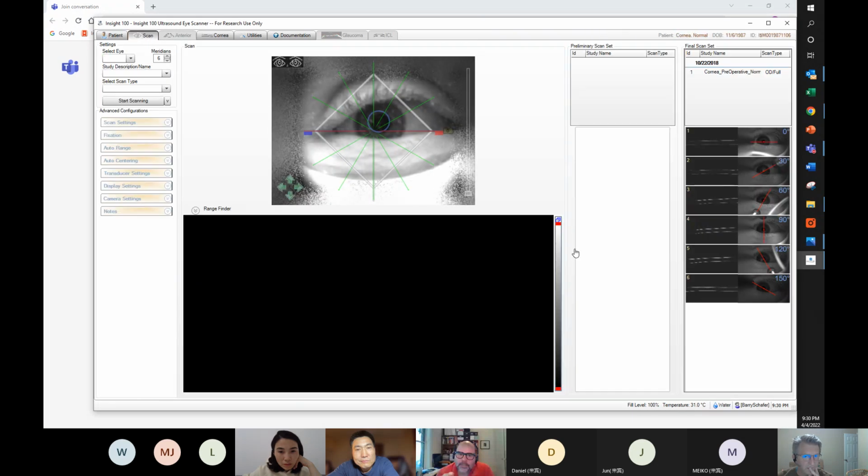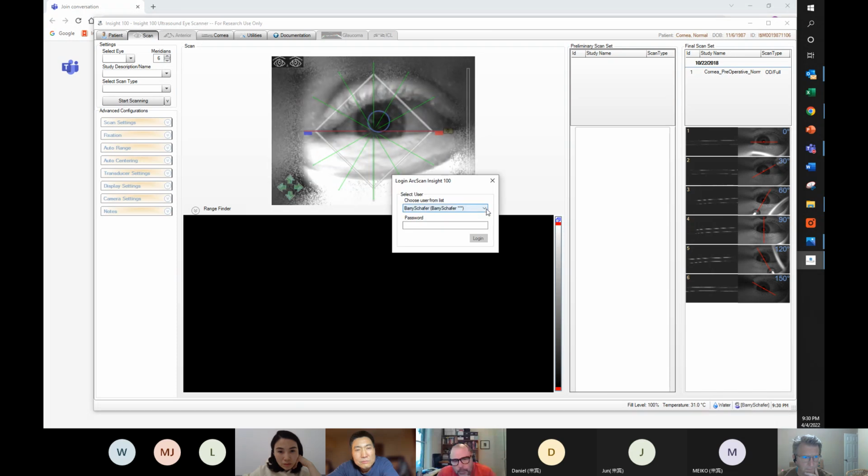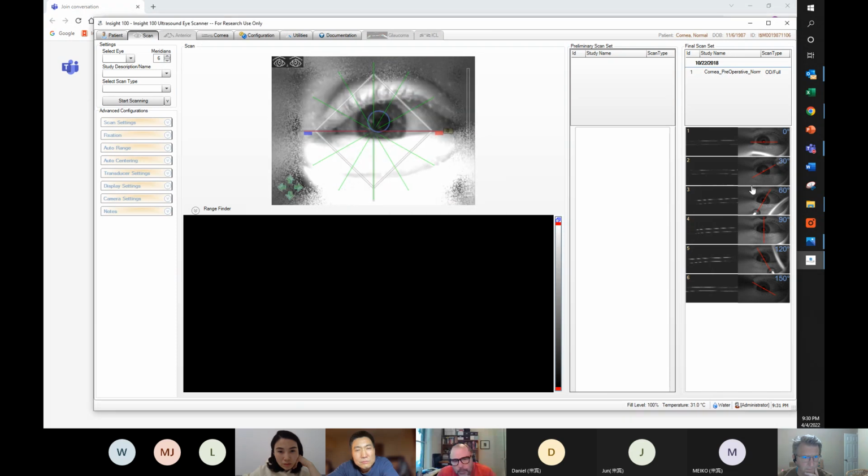They might be looking at the eye because that eye looks open. But when you see the lines, the lines are covered completely by the eyelids. And that is a problem. So it's not a problem of having the eye open or not. It's a problem of whether the area that I'm scanning is showing in the image, because I can do scanning of that eye to measure ICLs.